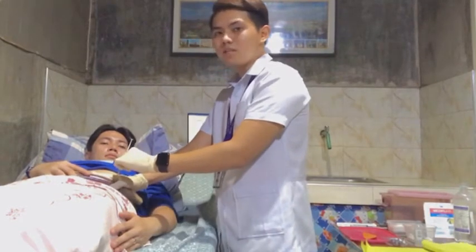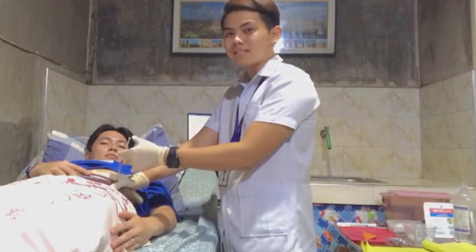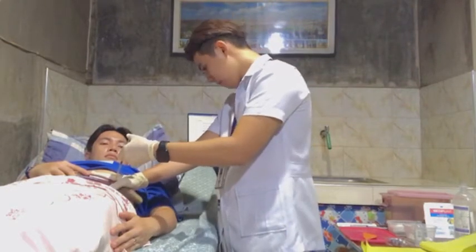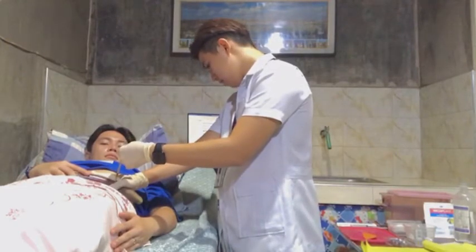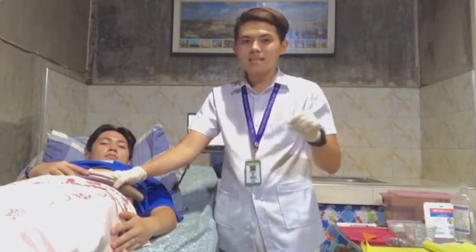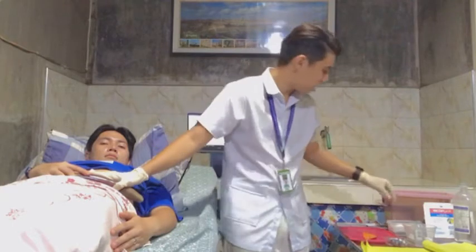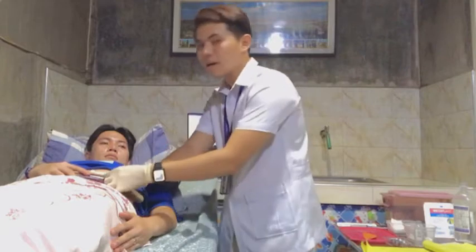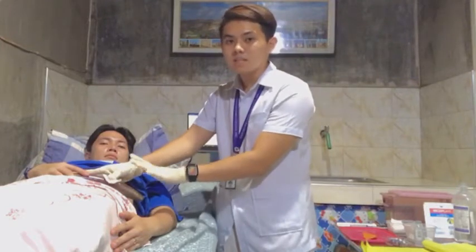So after that, we need to move our dominant hand to the end of the plunger and slowly inject the medication over several seconds, and retain your grasp on the syringe and keep it still. Okay. So after that, quickly withdraw the needle because depressing the skin provides counteraction and it also minimizes the patient's discomfort when the needle is withdrawn. Of course, after that, we will be placing a swab or a gauze pad on the site and apply gentle pressure, but do not massage the area.